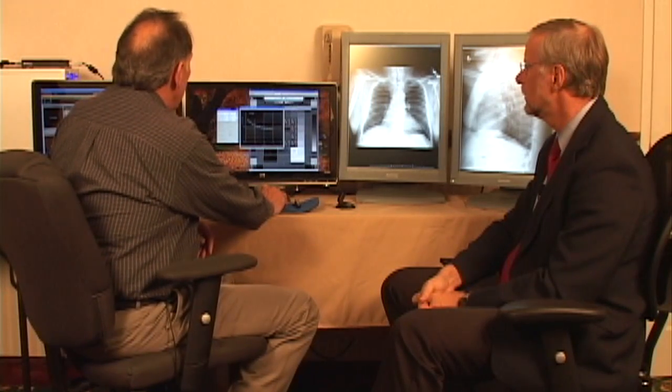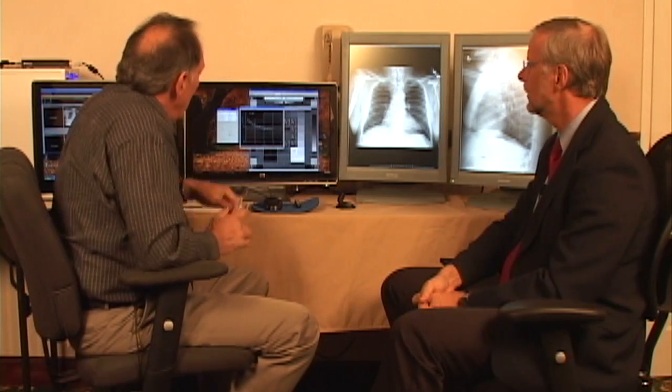If I change that to secondary tolerance, plus or minus 20% for clinical referral type applications, all the data points for this display are well within that parameter. So in the sense of being responsive to the grayscale display function, it's accurate.